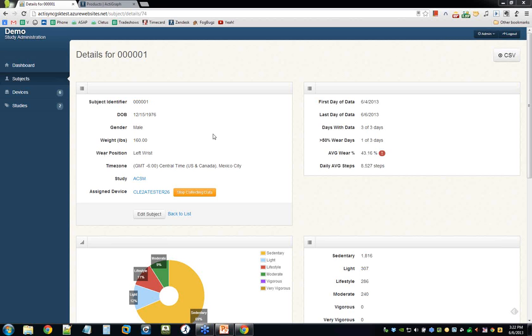Question from Linda asking about the advantage of the plus components of the GT3X. Yes, I'll be glad to tell you what the advantage is. Our older devices, the GT3X models and older, collected data at the epoch level. In other words, the data was filtered on the device to remove noise, and the user was forced to select a particular sample rate, a particular epoch level, so 1 second, 2 second, 5 second, 60 second epoch buckets. They were also forced to choose whether they wanted to collect step counts or ambient light, if the ambient light sensor was available on that model.